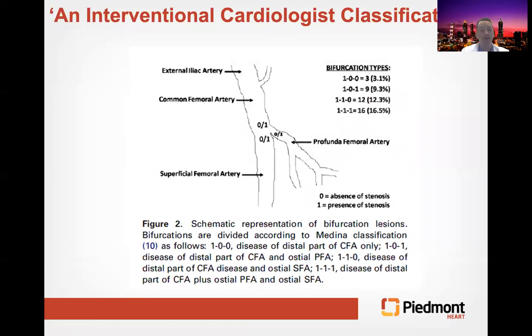There is another classification, which I call the interventional cardiologist classification. That's the Medina classification, and that's using the same exact presentation or classification scheme that we see in the coronary. So Medina 111 involving the PFA, the superficial, and the common femoral would be the most complex.